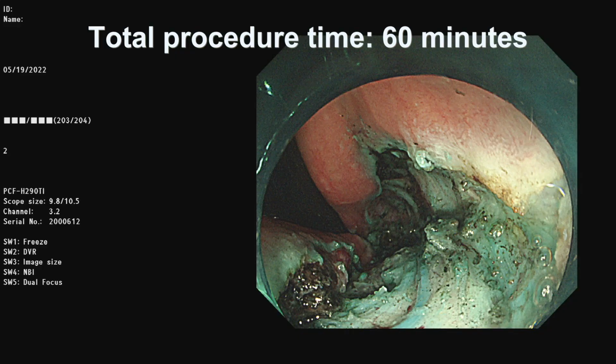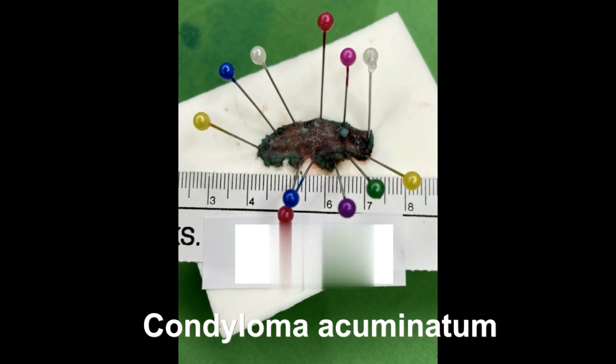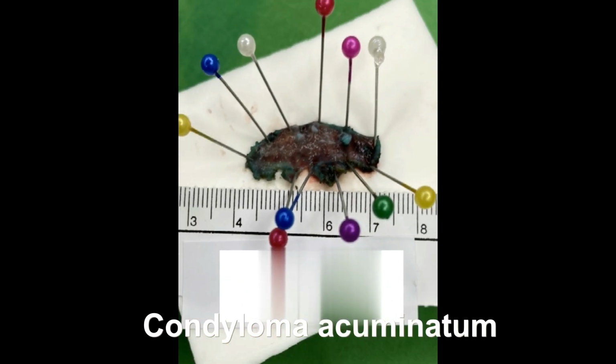The total procedure time was 60 minutes. Pathology proved to be condyloma acuminatum.